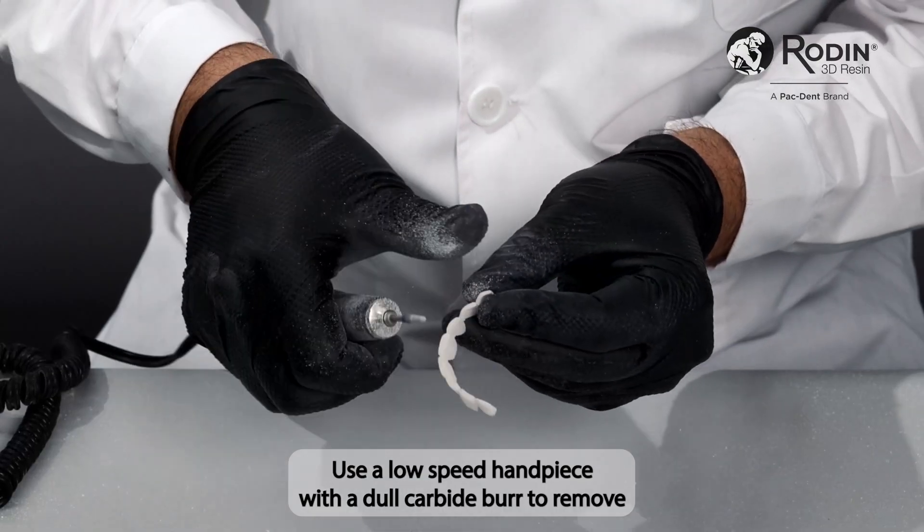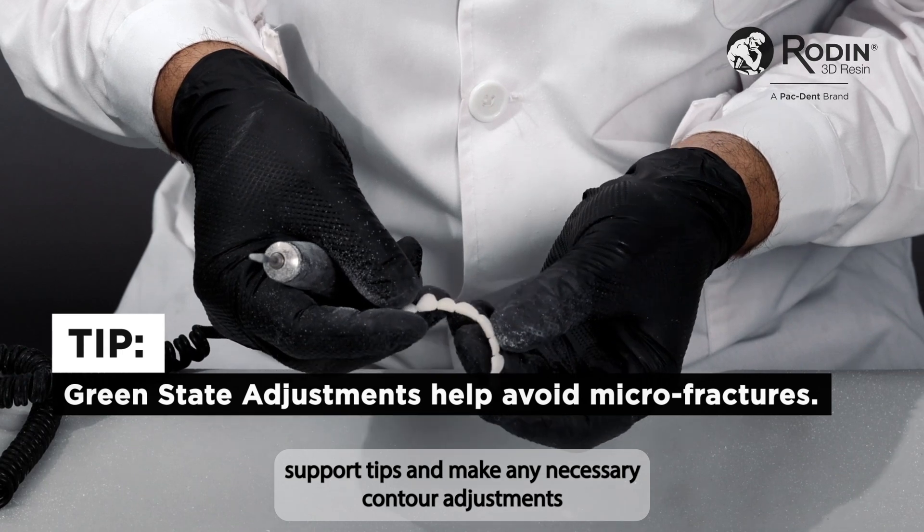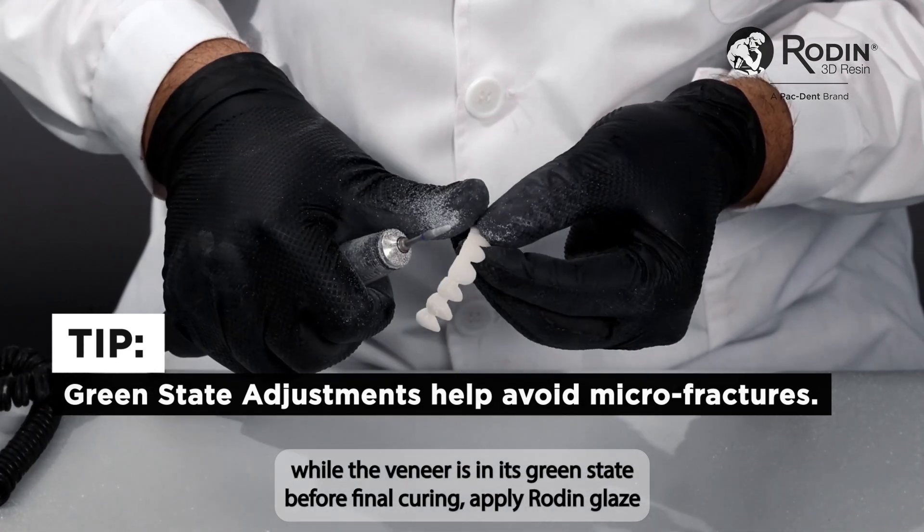Use a low-speed handpiece with a dull carbide burr to remove support tips and make any necessary contour adjustments while the veneer is in its green state.